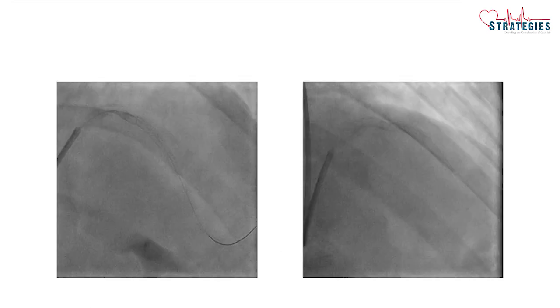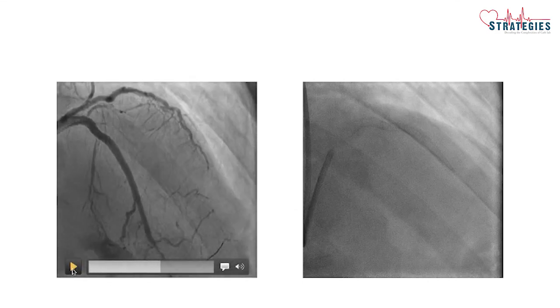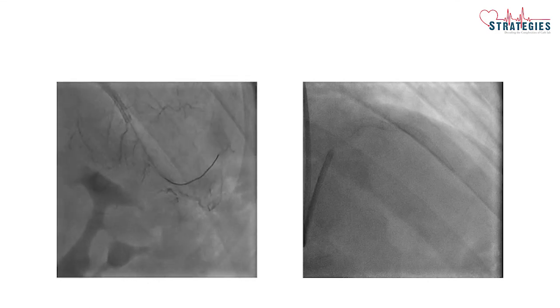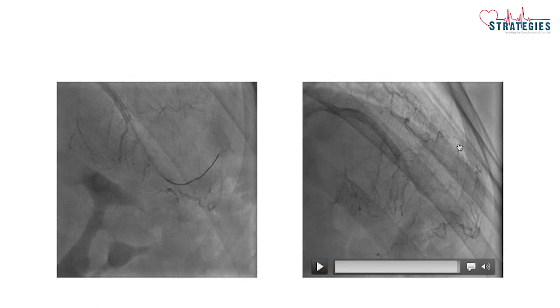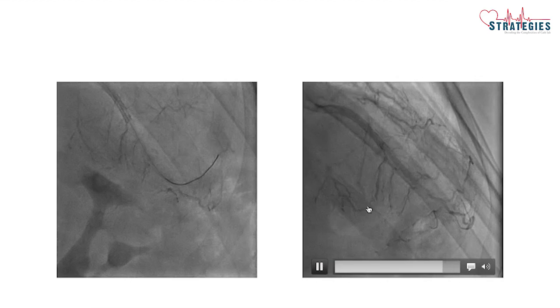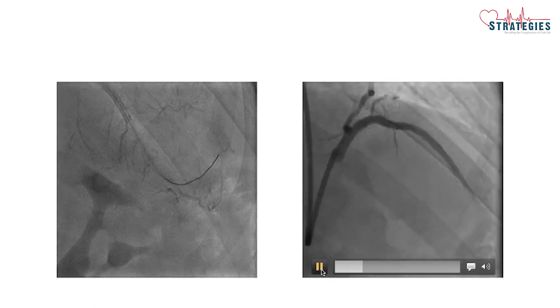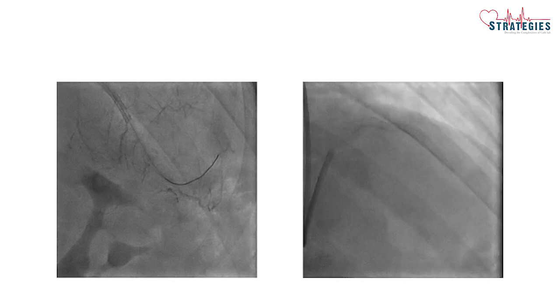Yeah, so this is an interesting IVUS, and these are the final angiograms showing nicely opened LAD, and diagonal is filling clearly from the other diagonal, distal diagonal, and both septal arteries are very clear, so they are filling. So this is a very interesting case, which we have done with the ipsilateral retrograde approach.